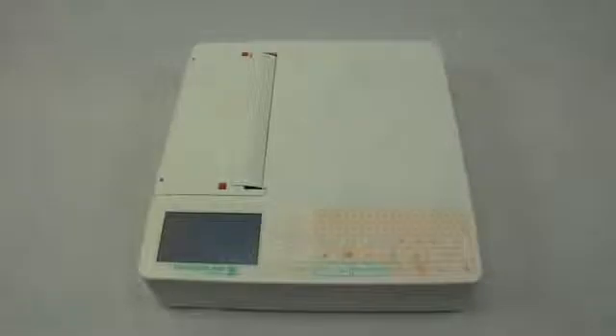You will notice the unit does have a QWERTY full keyboard. It is a soft touch technology, which is pretty neat. There is no need to depress the key very hard. It's completely sealed and flat, and it works very well.